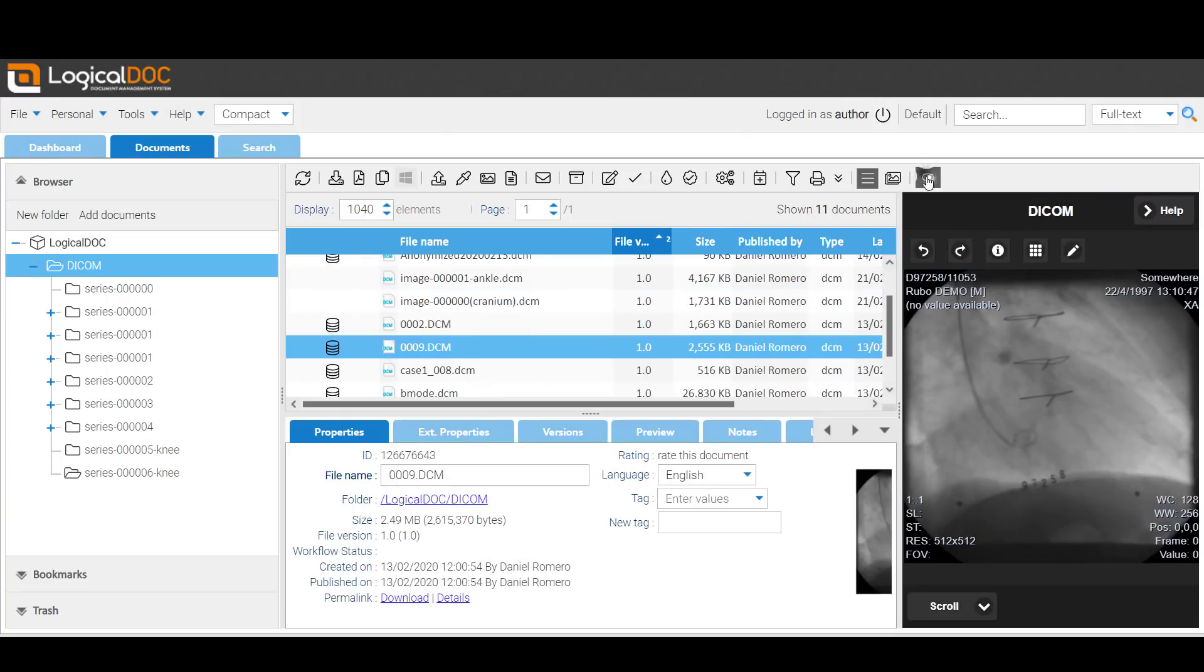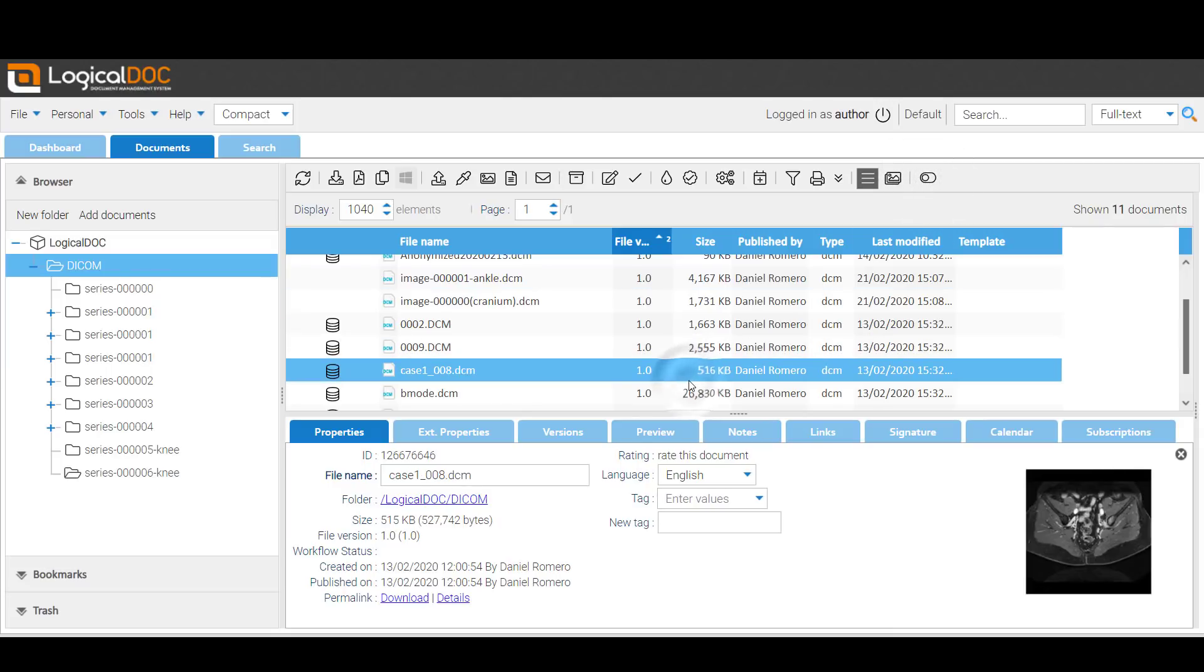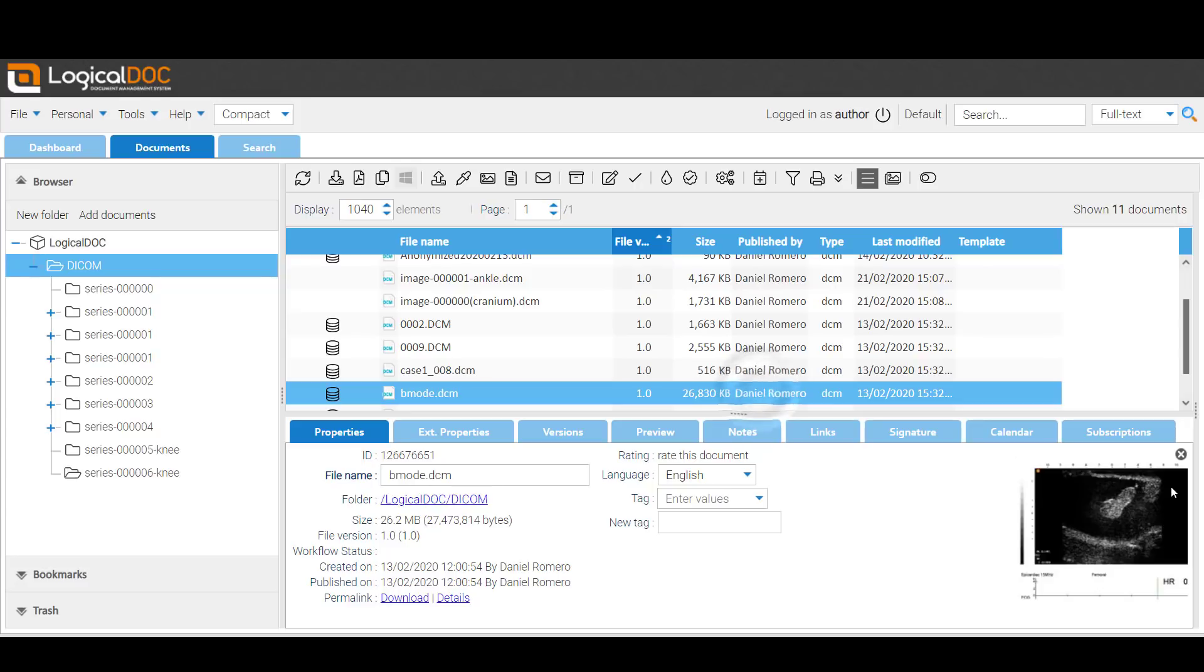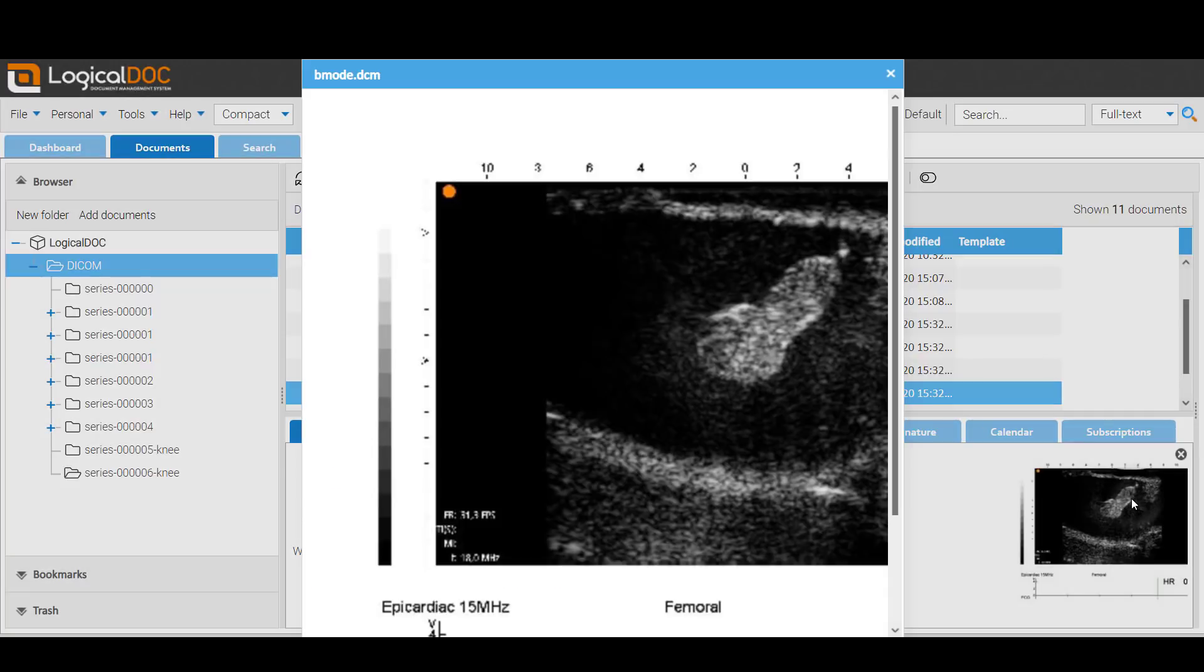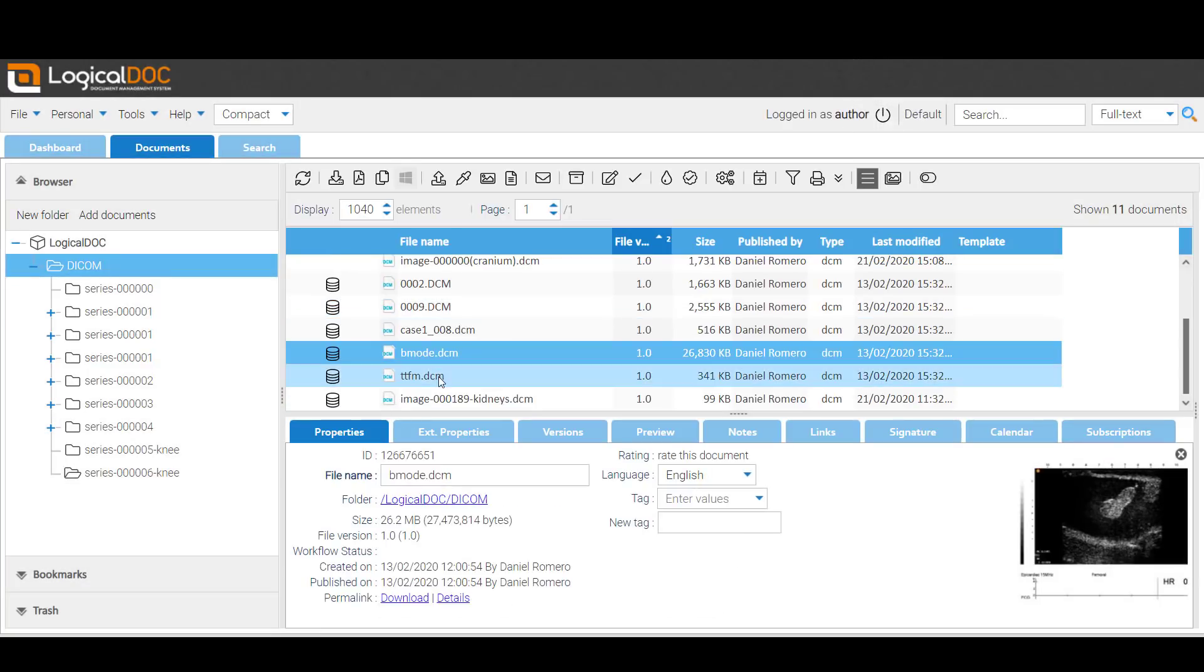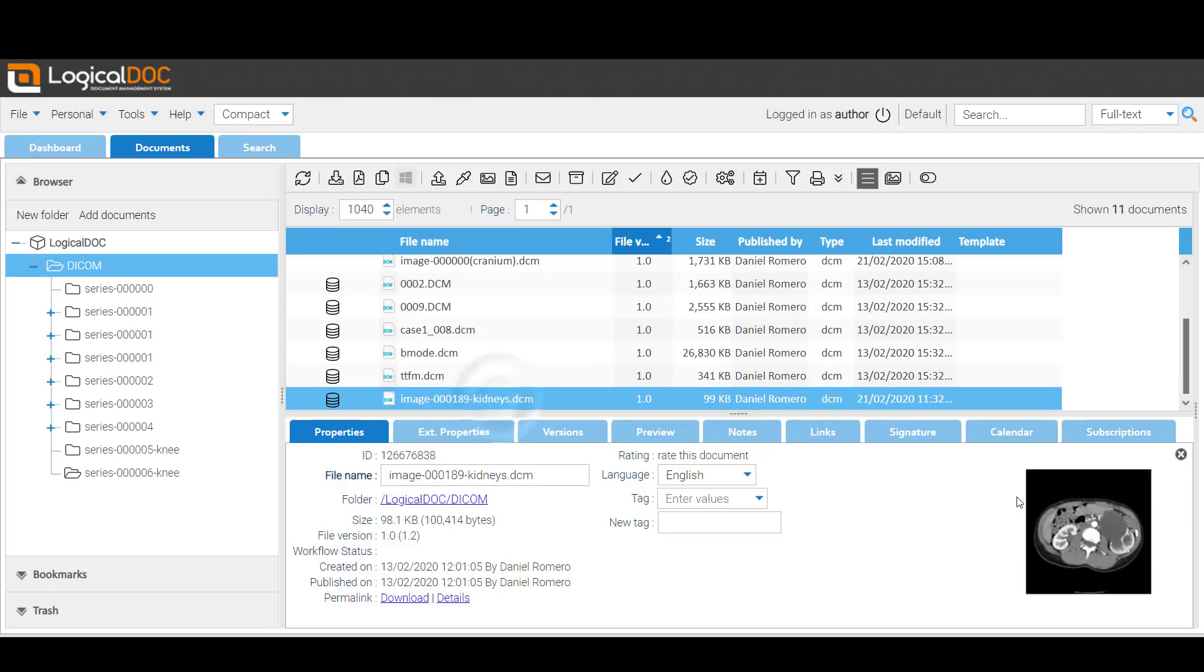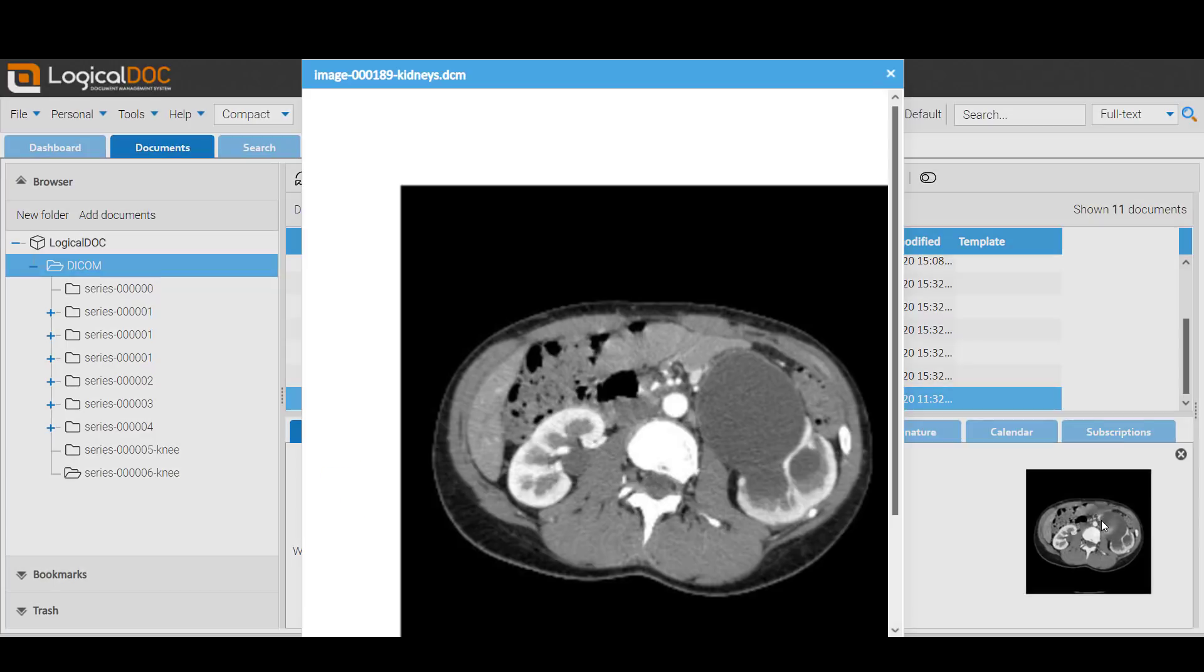The document thumbnail is displayed in the bottom panel. By clicking on the thumbnail, you can see an enlarged version of the image.